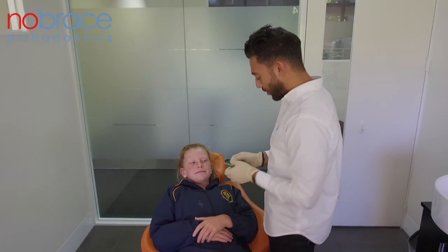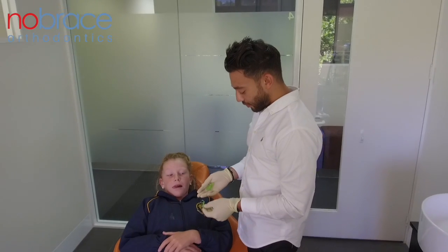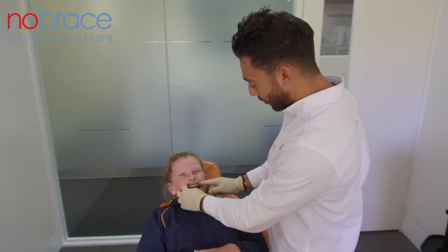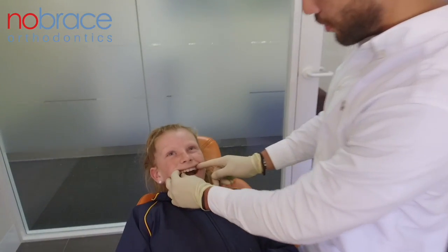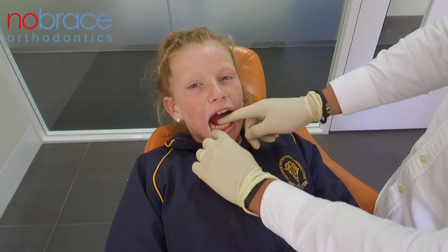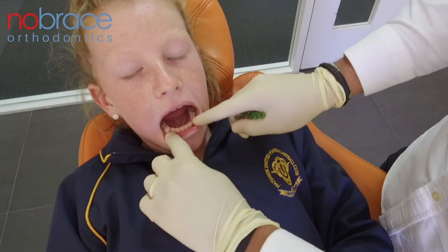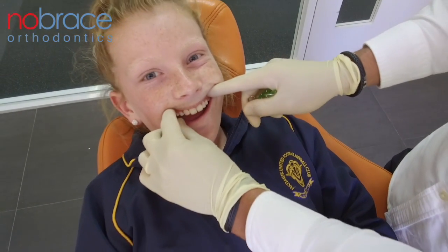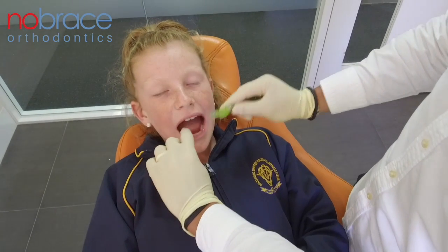What Macy is currently wearing is upper and lower removable expansion plates. She started off quite crowded, not fitting her permanent teeth, so what we've been doing is creating space. With her lower, we've now had space for her permanent canine to erupt into the arch, and we're doing the same on the upper.